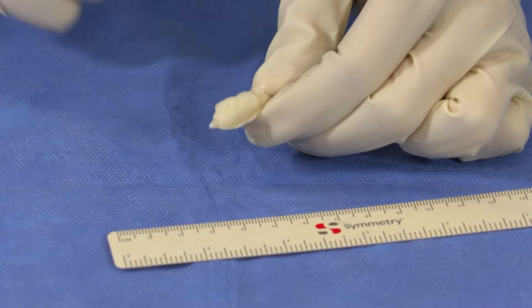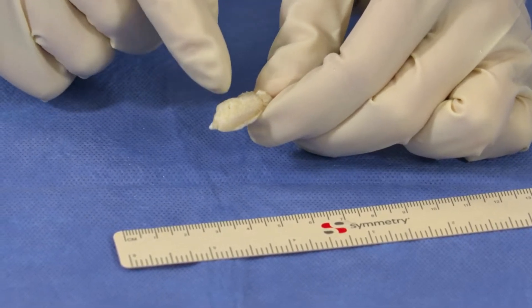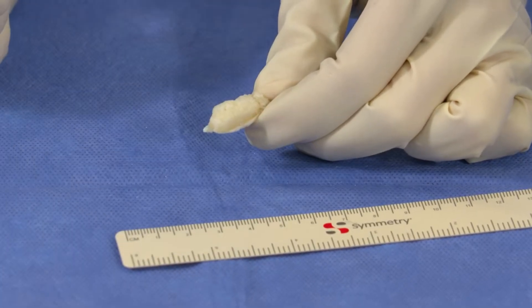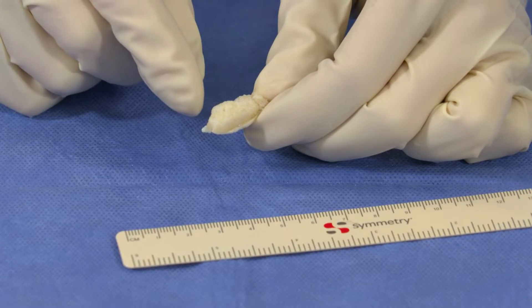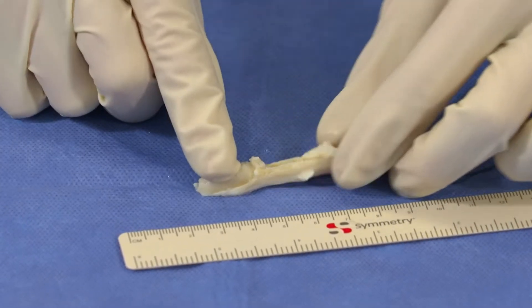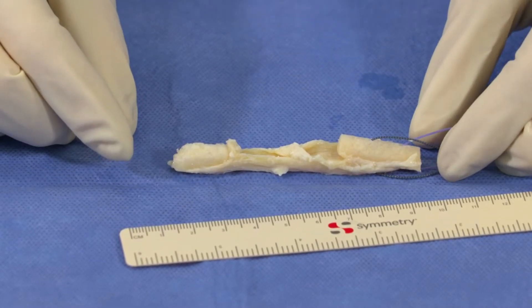We also have the two drill holes here. It's important to have the leading drill hole slightly closer to the edge so that you can direct the bone graft accordingly, but you also don't want that drill hole to pull out through the graft. Those are the key features in your graft preparation for the BTB ACL reconstruction.